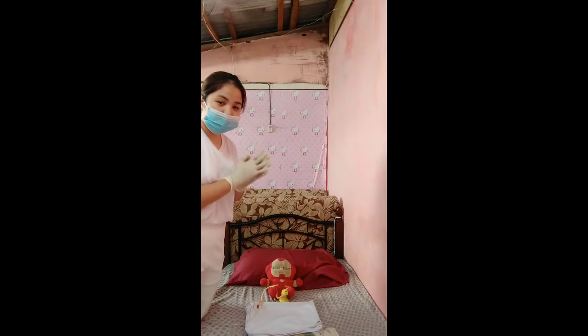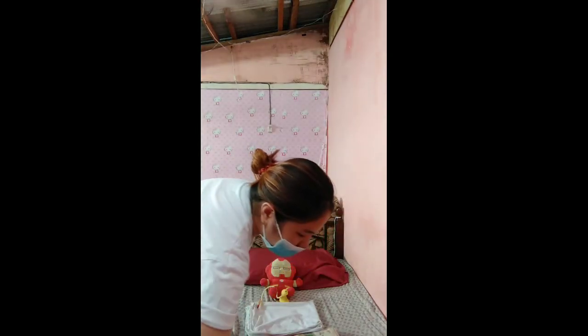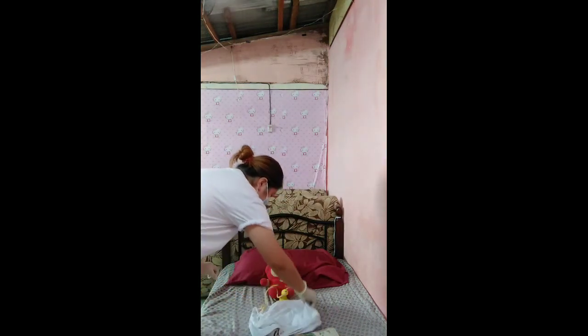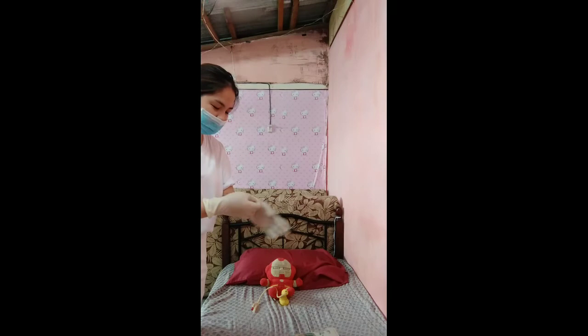So we need to dispose of all the materials used in this procedure. So we're putting this away, the materials used here. And remove the sterile gloves from our hands.